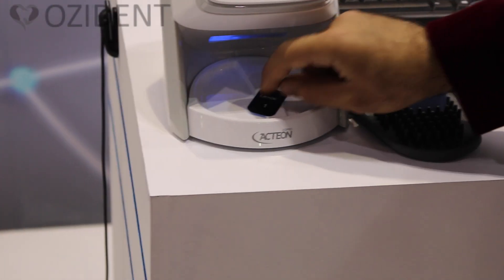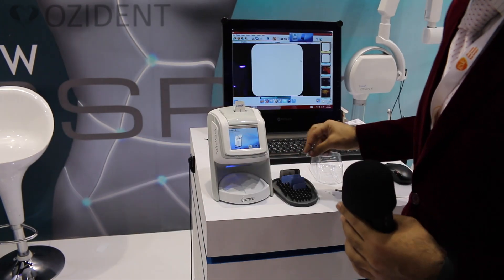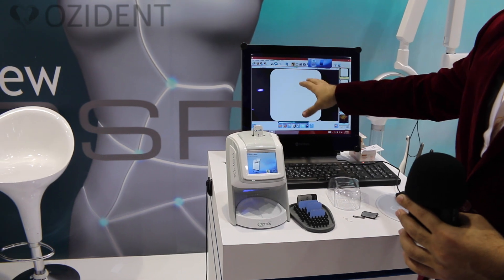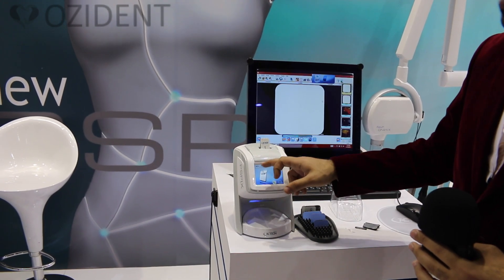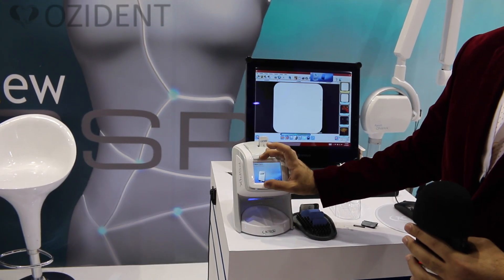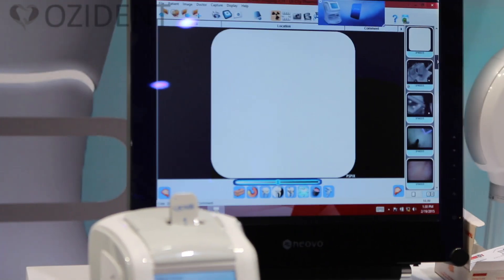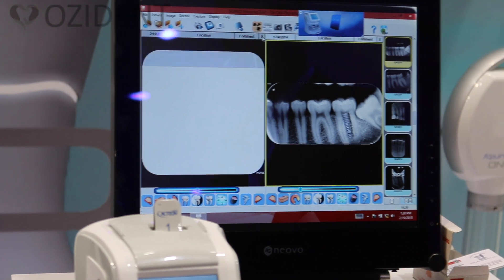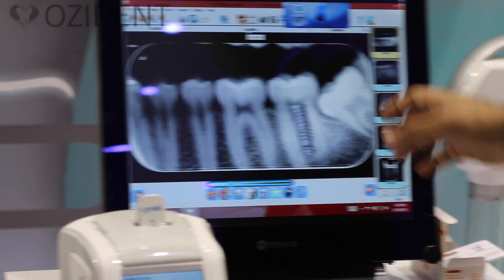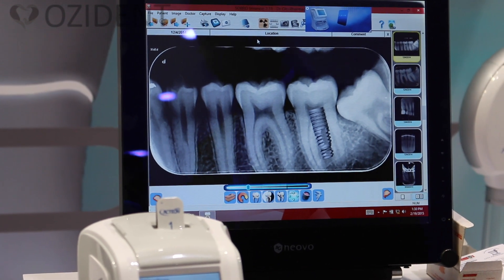After that, the image has been scanned and erased from the film. So immediately you can put it in a new pouch and use it for the next patient or next exposure. Because this film was empty the image is white, but if an exposure was done you will have a preview here. Here is an example — this image was taken with size 3.